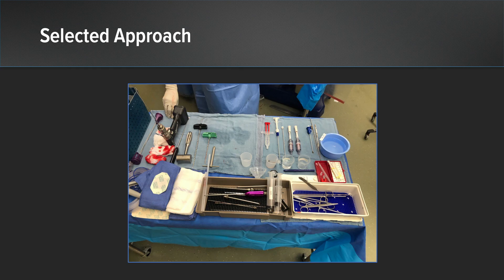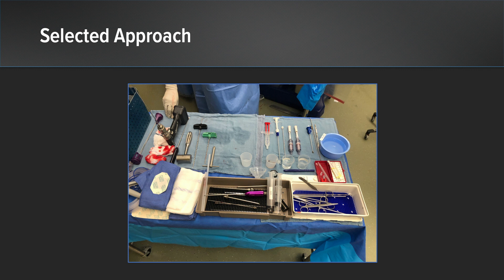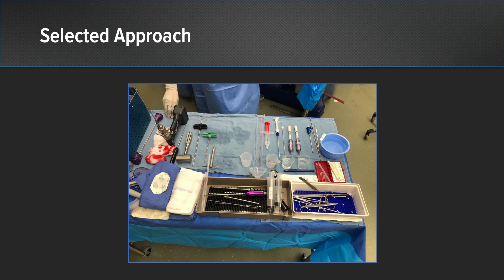This is the setup on our back table. You can see a very well-organized system. I think personally it's very important to have a very well-versed support rep in the room to make sure that when you're using a number of different biologic options, things are organized in a systematic fashion so that there are no unfortunate mistakes.